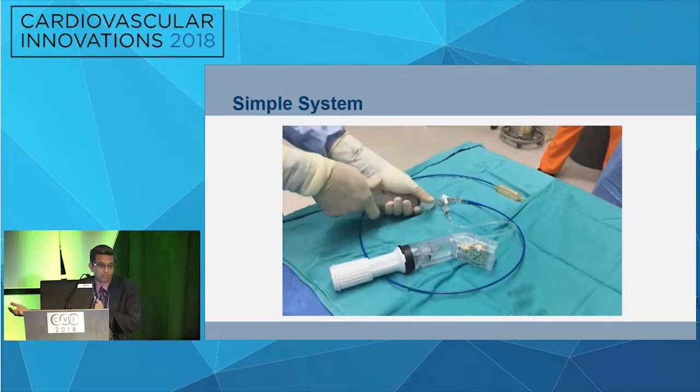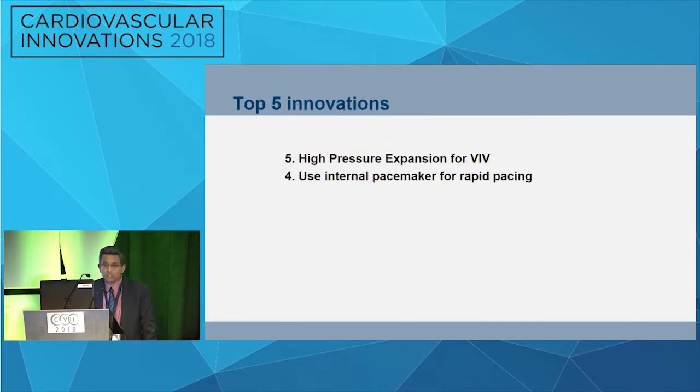Patient may have a seizure. So this is okay. You know, I tell our anesthesiologists that seizure is part of TAVR. So if sometimes they seize a little bit, they will come back.